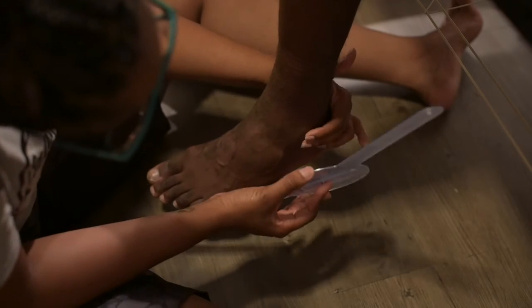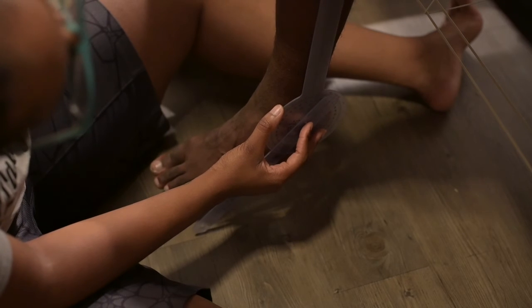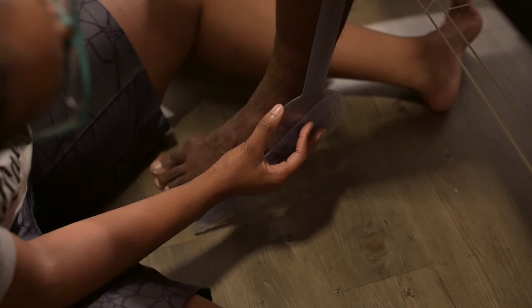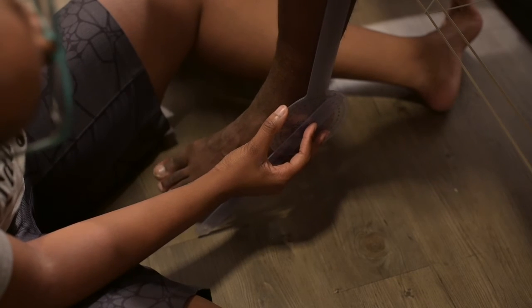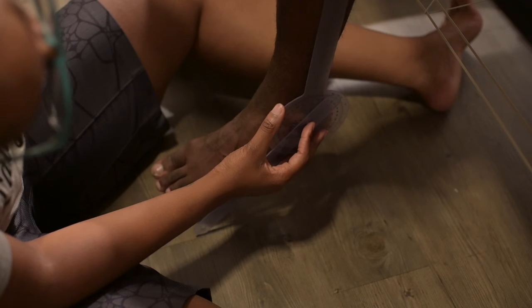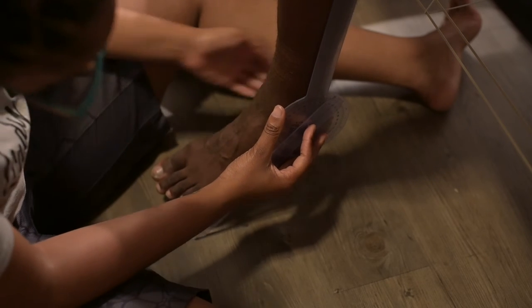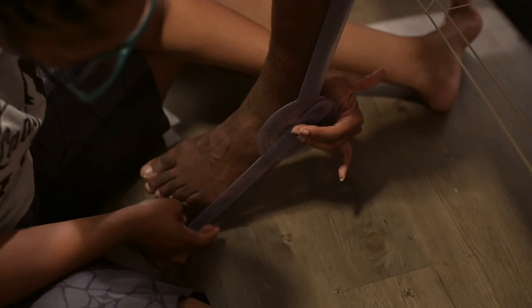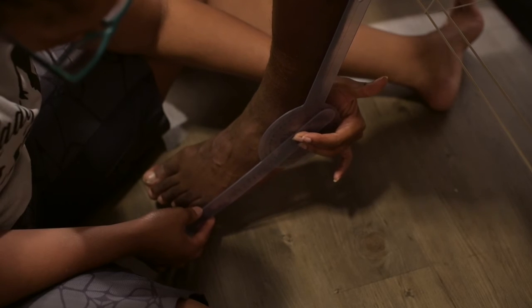So lateral malleolus, axis of rotation, fibular head, palpable to align the stationary arm. And the mobile arm will be, so you can see, at the 5th metatarsal. So go ahead and plantar flex downward.